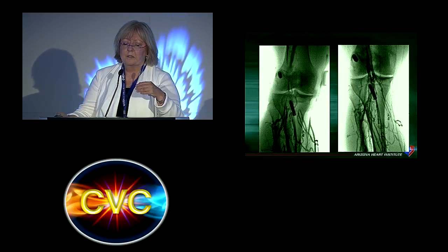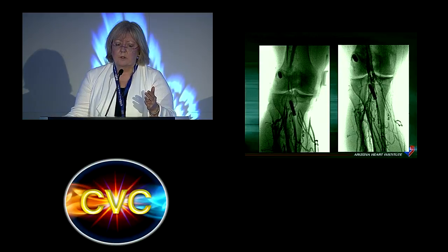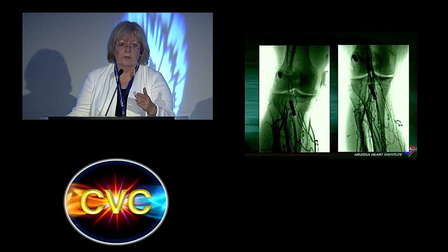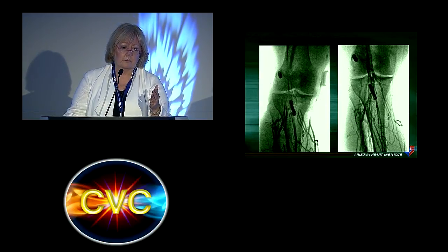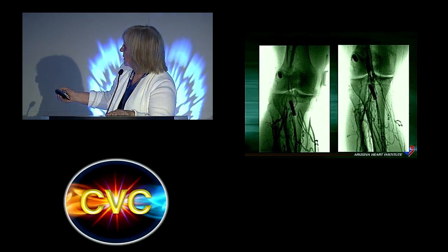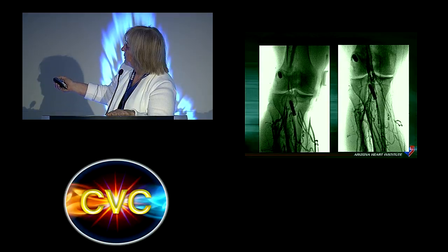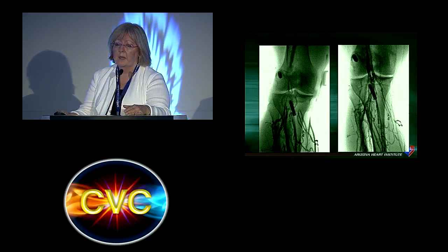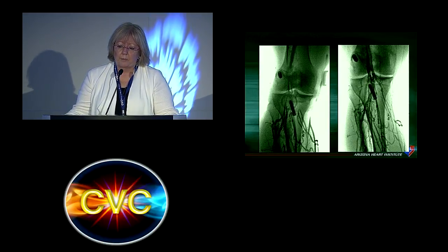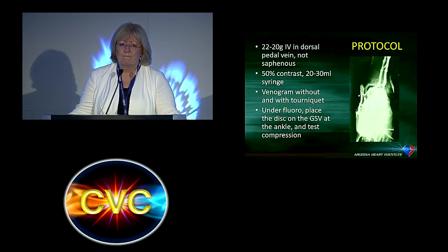Now, what I've always said about DVT venograms is the vein doesn't have to look perfect to work well. So we're treating the patient and how well it works. So we can't make it look perfect after a long series of, many days of disease, but we can make it work better. And that's what our goal is. Look at now, there's flow through the popliteal veins that were not even visible before, but after a few days of infusing with TPA, which is very easy on the patient, and it's a very effective therapy, no intervention except the TPA, you get this nice result.